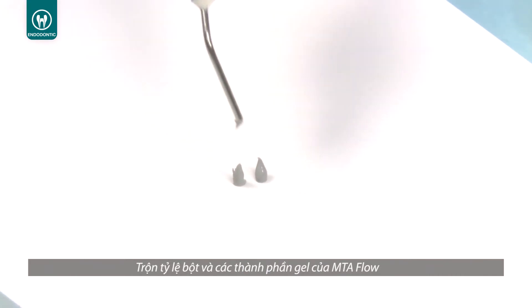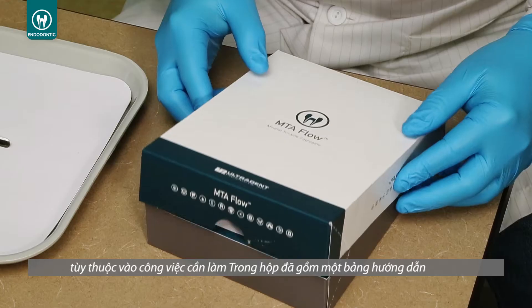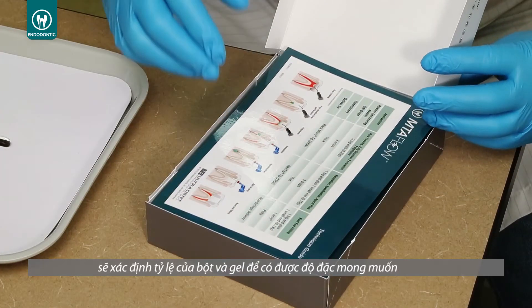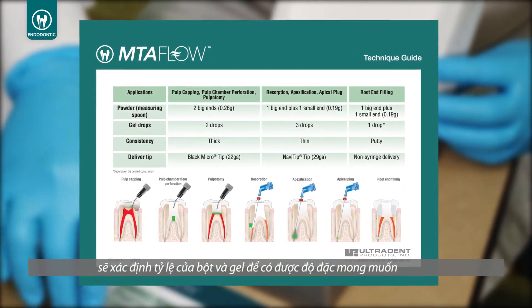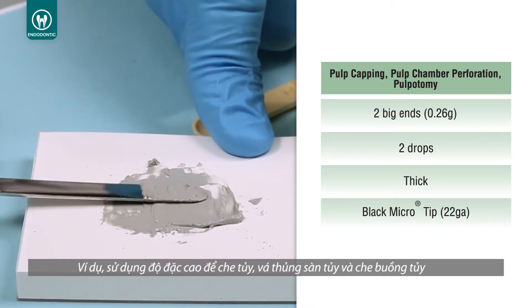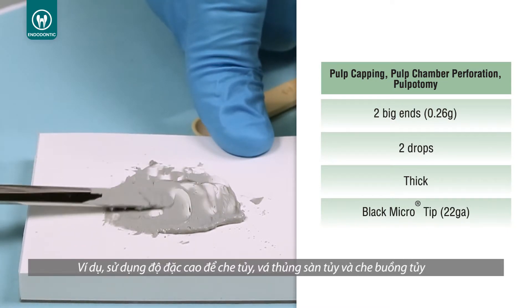The mixing ratio of powder and gel components of MTA Flow is adaptable based on procedure. A guide is included in the kit which will define the ratio of powder to gel to obtain the consistency desired. For example, use a thick consistency for pulp capping, pulp chamber perforation, and pulpotomy.